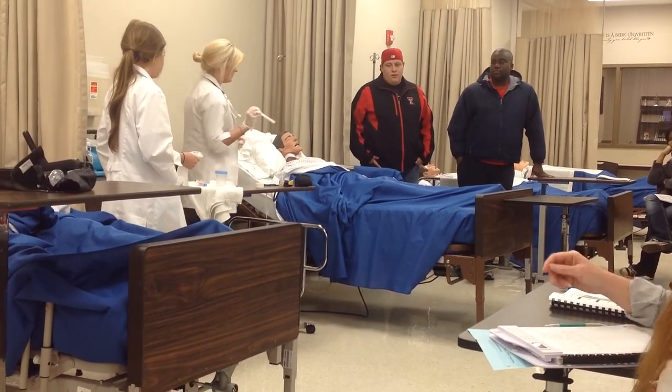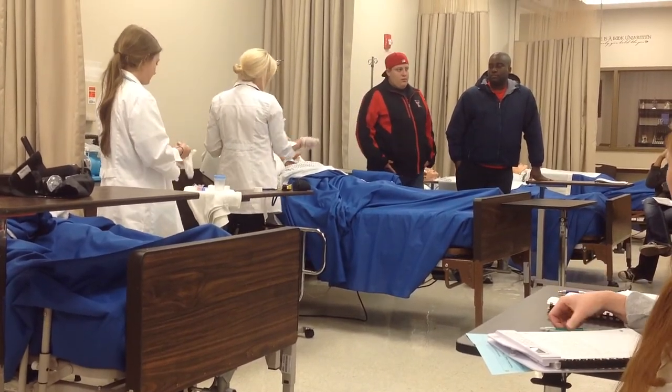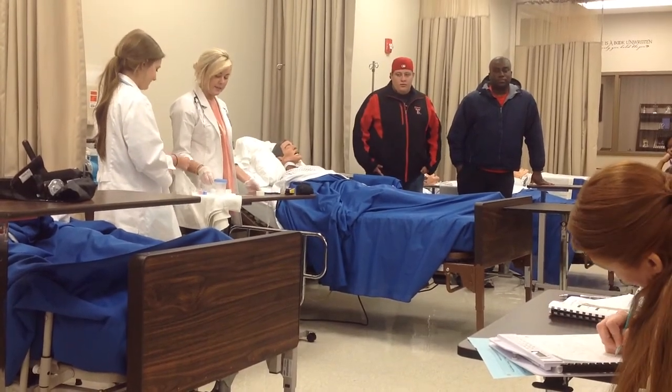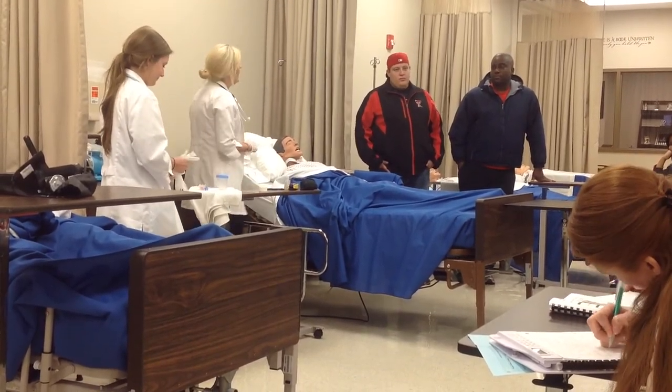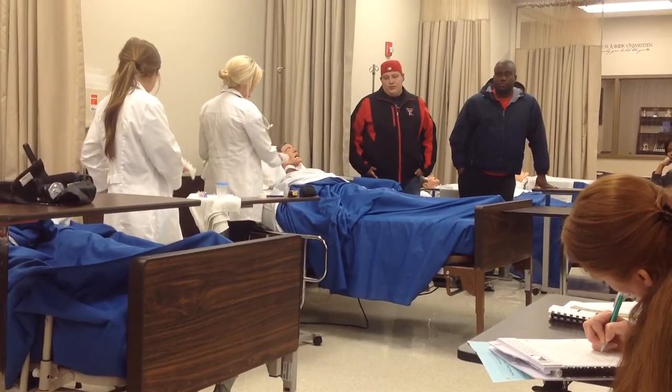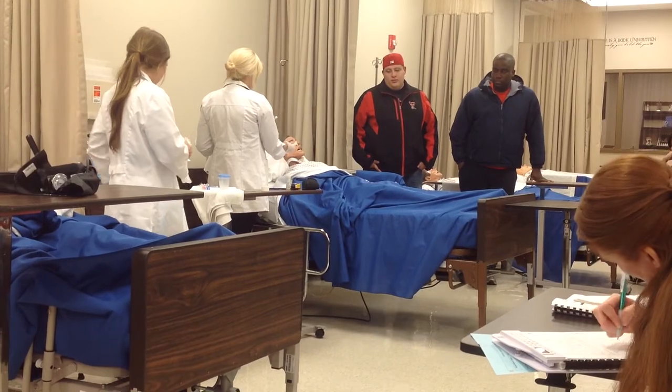And assess your patient for a gag reflex. You do not want them to have a gag reflex, otherwise they will gag up the airway, and that's not good. So, you're going to want to measure your airway up to here, and you're just going to want to do it from the corner of the mouth to here. So, like that.